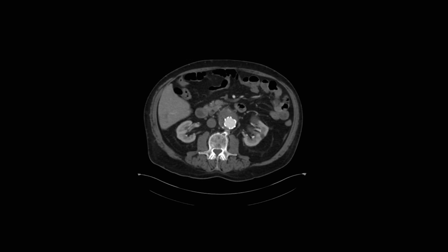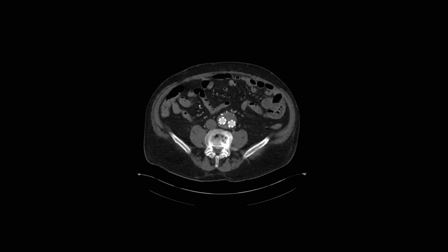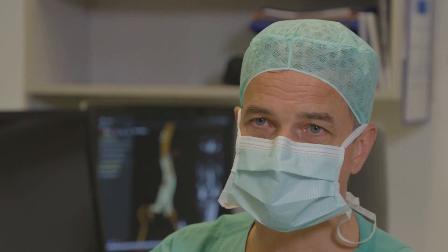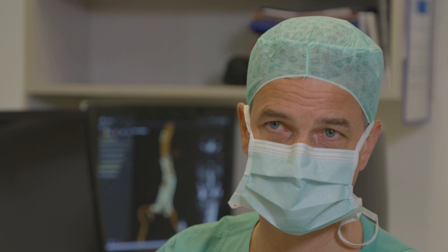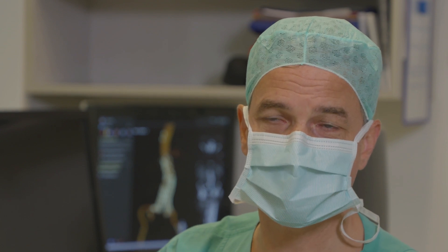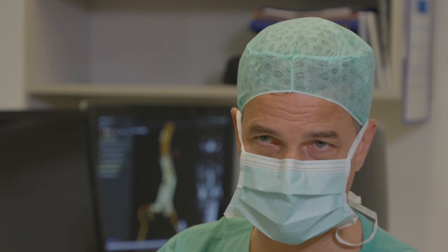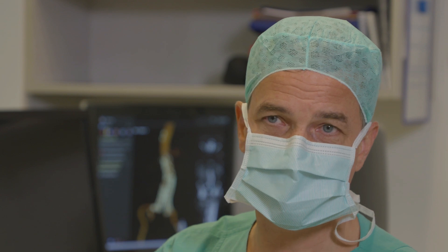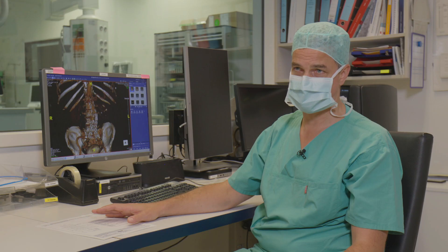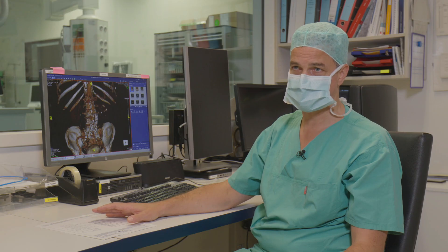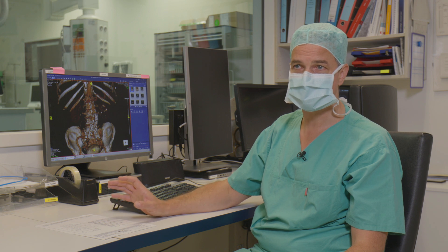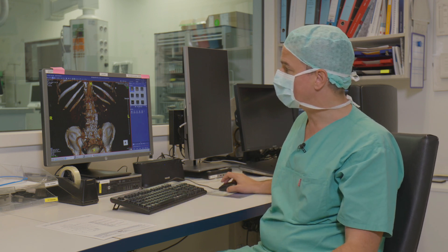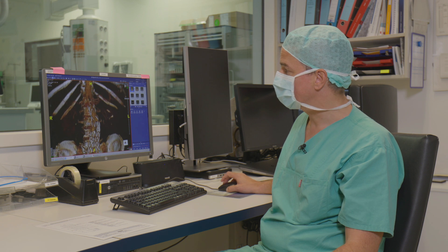Now we have pressure conduction into the aneurysm sac, and the aneurysm sac has grown to 7.5 cm in diameter. Of course, this is not an everyday case, because this patient already has an infrarenal device in place. And this can make fenestrated branch procedures challenging, as the stent struts from the older proximal bare stent can be in the way when catheterizing the target vessels.